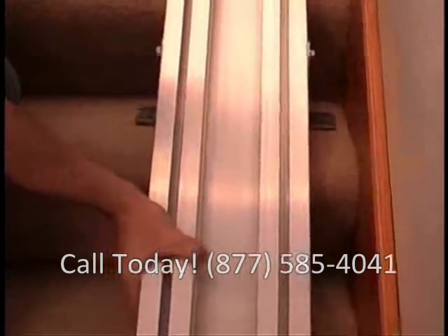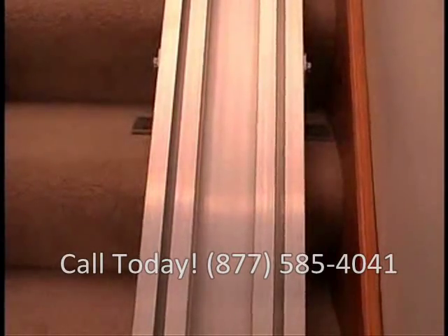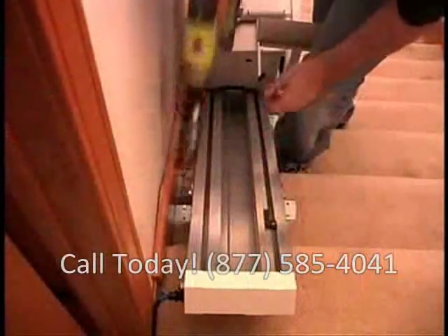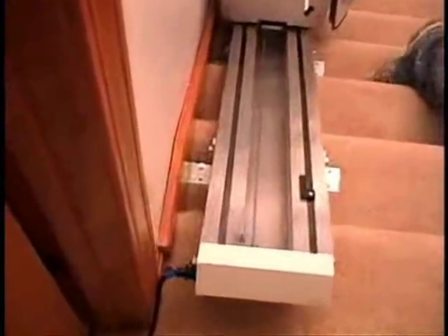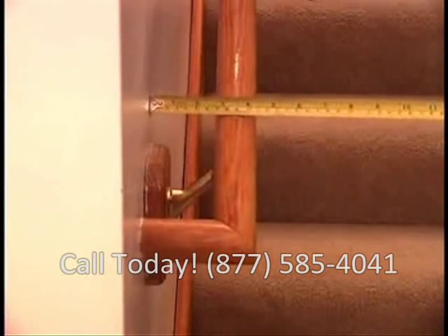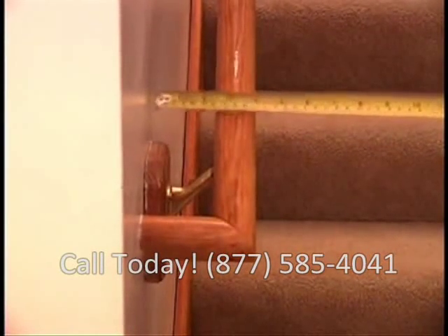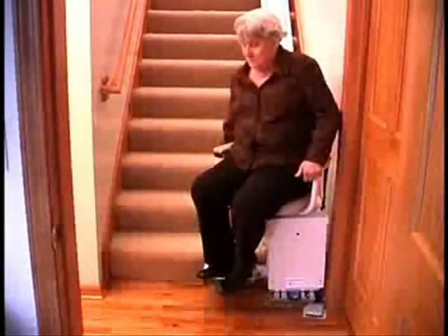Now you're ready to slide the track up against the wall or molding. The brackets are designed to position the unit the required two inches from the wall. Please note: if there is an obstruction such as a window sill or handrail, the track needs to be positioned two inches out from the obstruction. If your lift was ordered with the optional wide seat, the track needs to be positioned three and one half inches from the wall or obstruction.